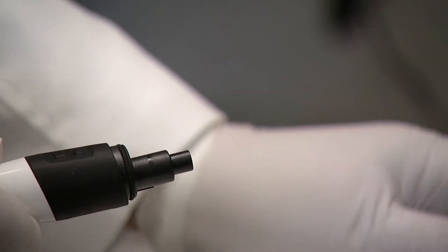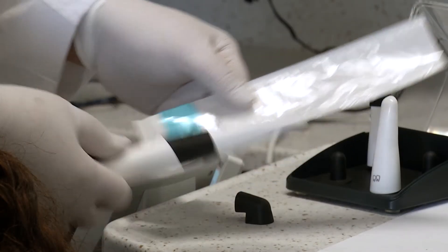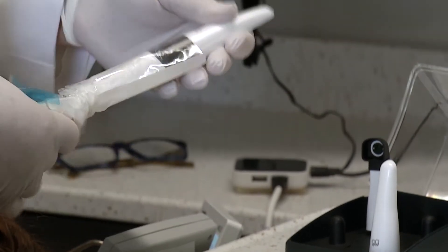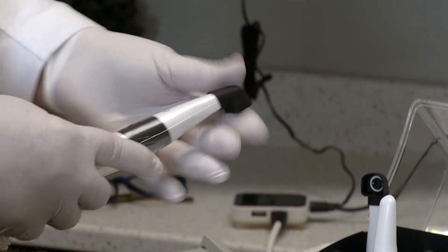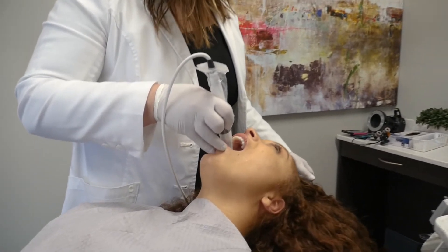With the head of the camera facing away from me, I simply place the ProxyHead onto the body of the CAM-X Triton. Then I place the protective sheet over the ProxyHead with the blue stripe facing towards me. The proper placement is an important step — it creates an effective barrier for infection control. The CAM-X Triton is now equipped with the ProxyHead for use as an interproximal caries detection device.